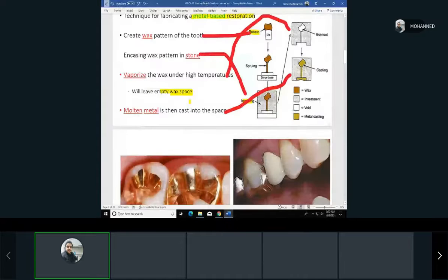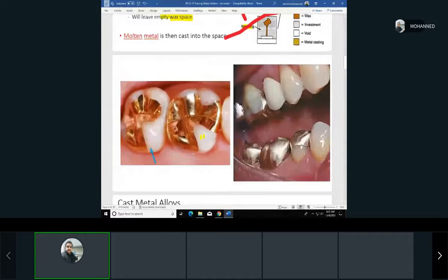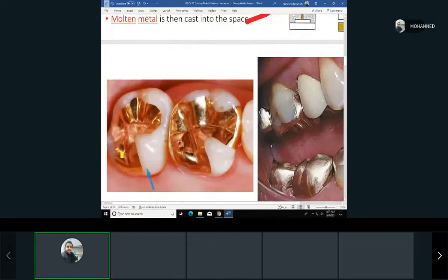Anyway, moving on. Just to show you, this is what an onlay would look like on a real tooth. You see how this is technically almost an inlay, because you're not replacing a crown. This is an onlay because you can see it's replacing multiple cusps. It's not a crown made on the tooth, right? It's just an onlay because we're not replacing the whole thing. We're only replacing some cusps of it.